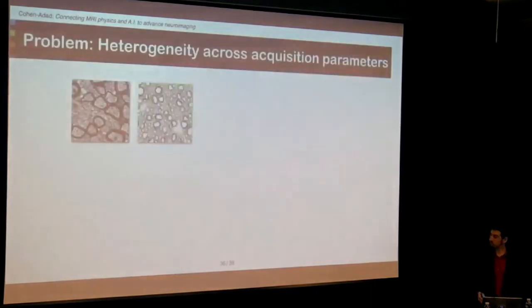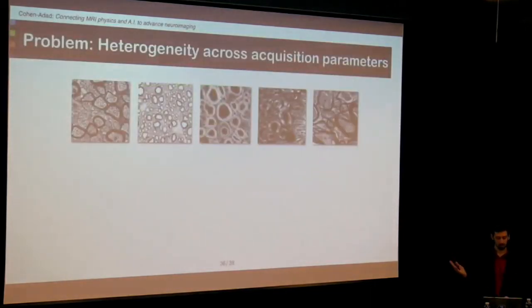The problem is researchers around the world started to download AxonDeepSeg, tried this on their data, and they emailed us, well, it doesn't really work, doesn't do a great job, is really far from what you're showing, and so on. And that's obviously due to the fact that, similarly to MRI, there is also a large variability of image quality and features with histology. Users have specific needs.